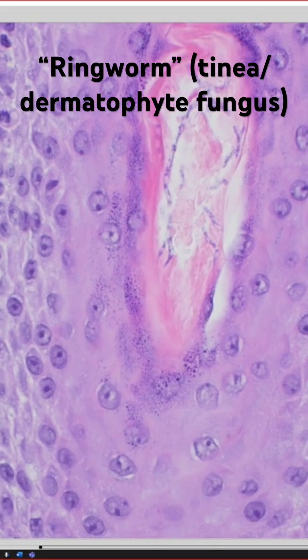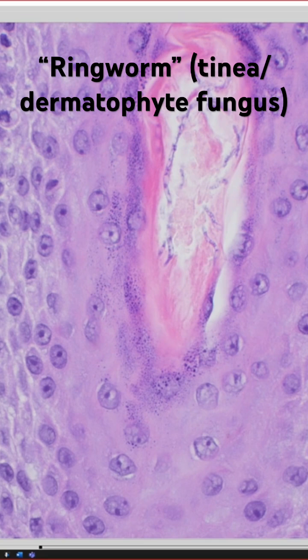In some cases they can go down and just involve the hair shaft, which we call — particularly in tinea capitis on the scalp — either endothrix or ectothrix pattern of infection. In those cases you may not have any organisms on the surface. So don't forget to check the hair follicles.